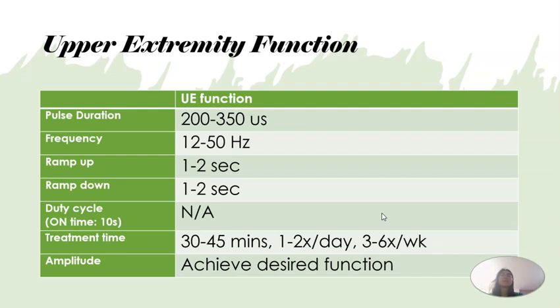Okay, sa F2F malaman yan kung ano yung achieve desired function na yan. So, hindi necessarily na yung ES na yung gagawa ng 100% work ng, for example, pag-release ng object. At least, ang gusto natin dito, at least it would help initiate the action.